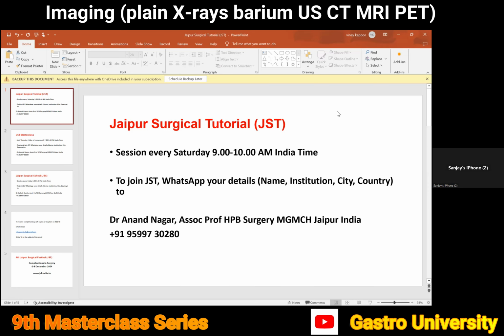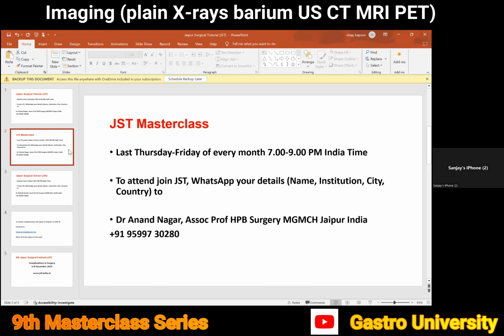You see, if you are doing PET CT studies, one should be clear. Normally, it can be like any CT, it can be done with CT contrast or without. Based on the indication, what we are looking for, whether the referring physician suggests or we think is appropriate, we add the contrast. We don't add it right and left. A lot of private centers in India, as a routine protocol, do all their PET CT studies with contrast, simply based on the premise that something should not be missed, right? So they want to do it.